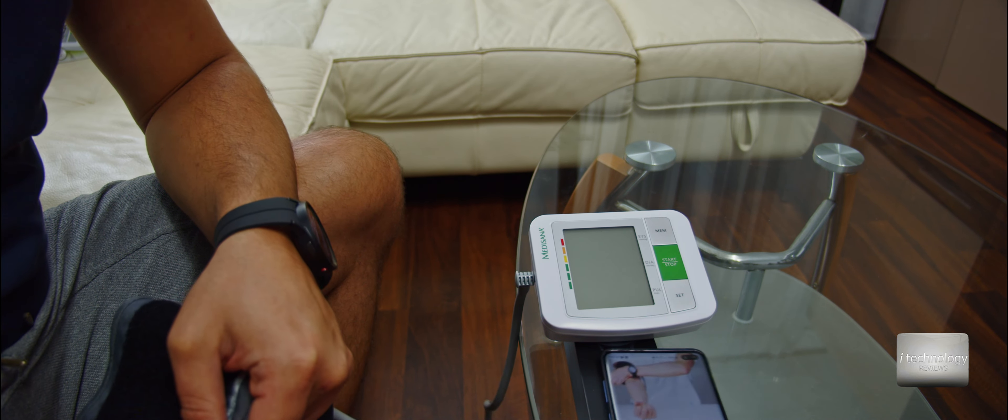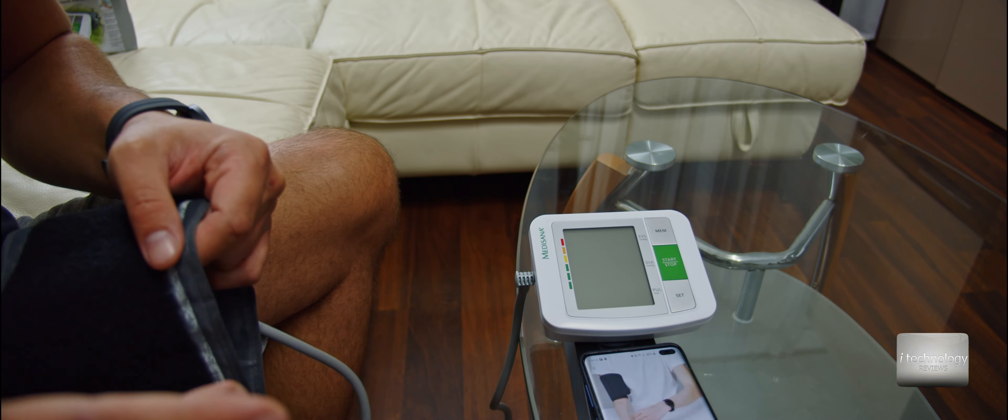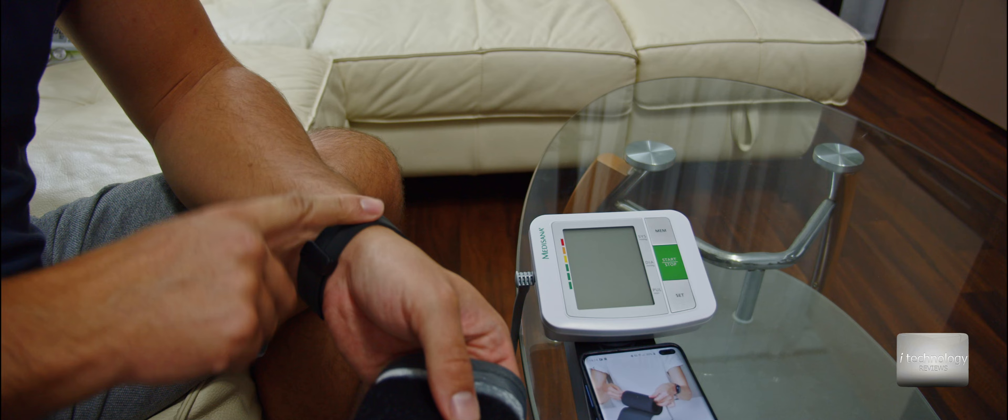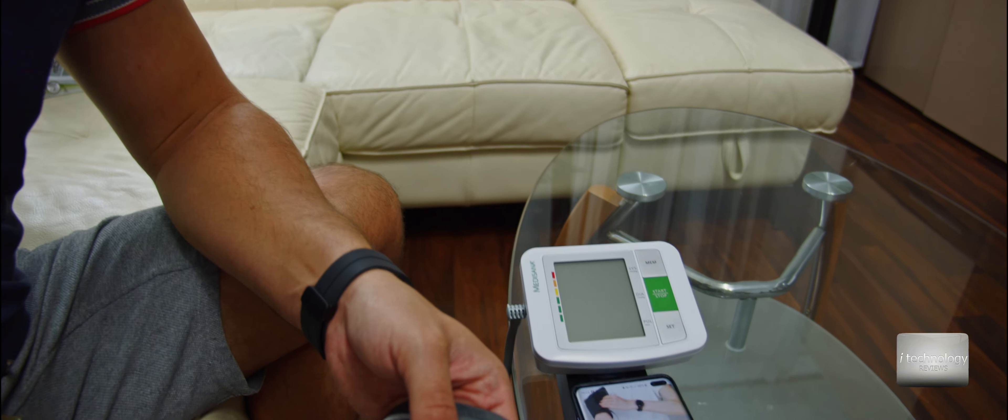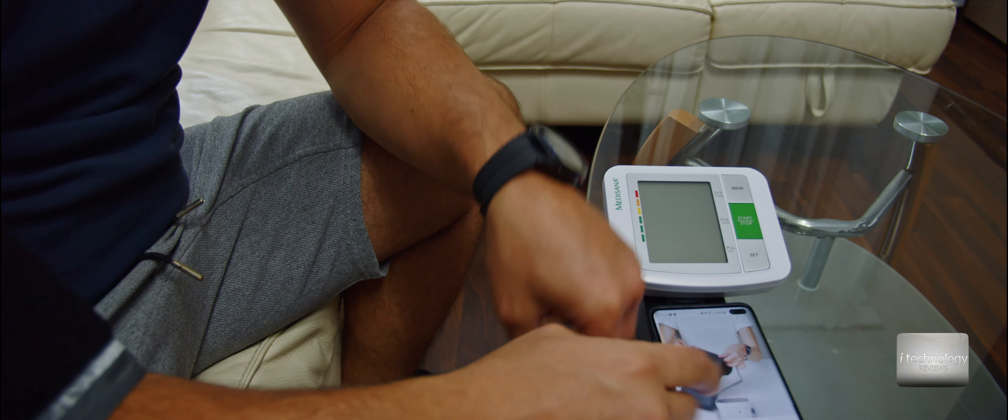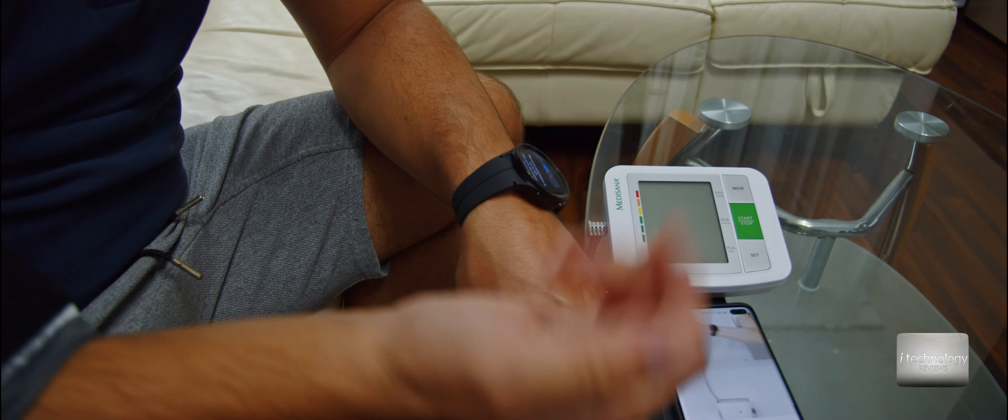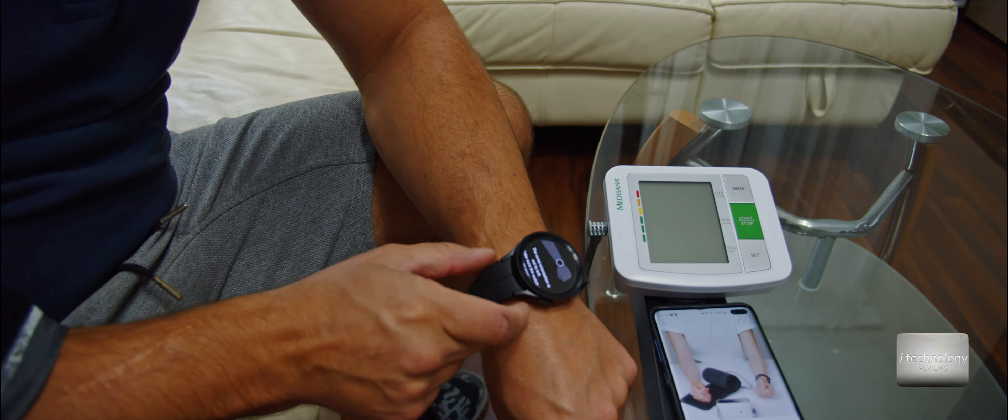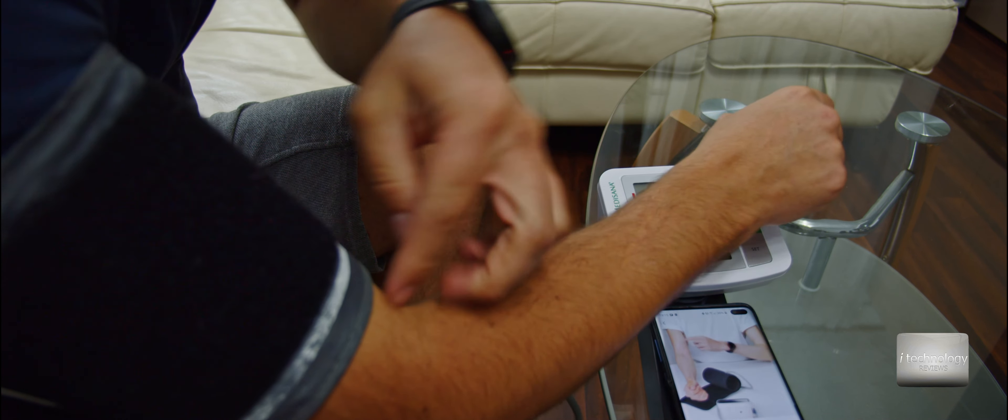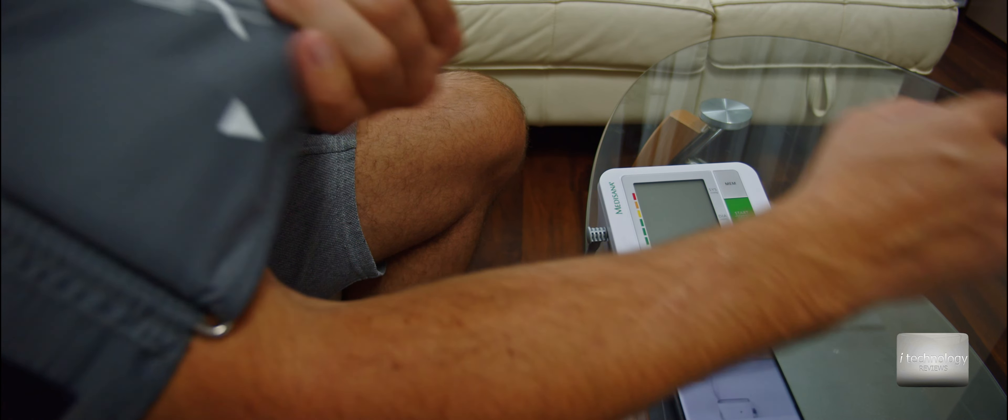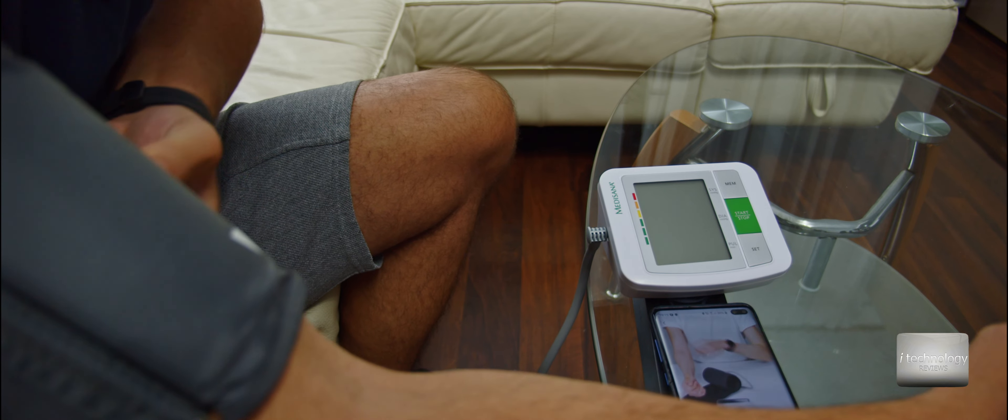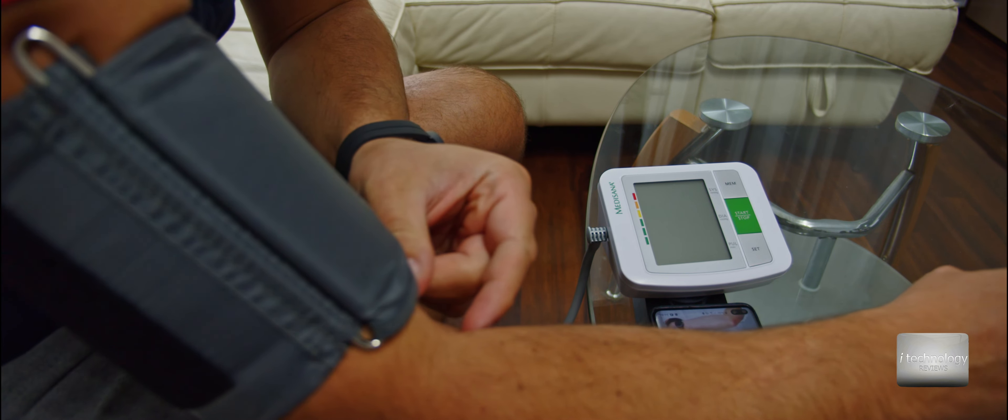You've got to put it on the other hand, because if you are putting it on the same hand, it will not measure quite good. Let me put it on my other arm. You've got to put the medical device to the other arm. If you're putting it on the arm that has the watch, it will not be accurate. Leave two or three centimeters right to the elbow and put it tight.